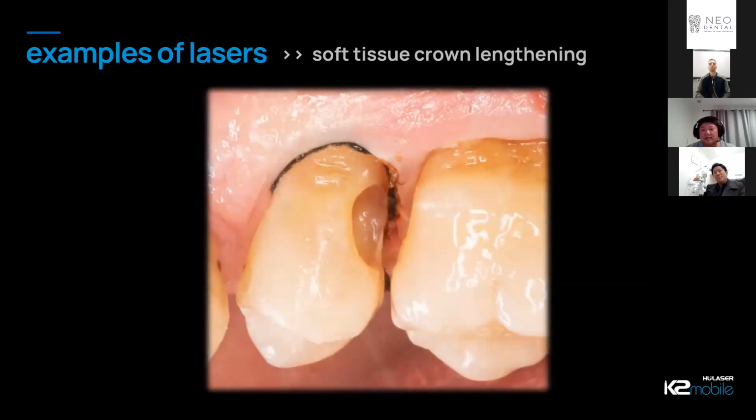And likewise here, this is a combination case where she had quite deep caries into proximity, but I couldn't justify breaking that distal marginal ridge, so we've gone for a buccal access. But there was just a lip of tissue that was growing there, so I've lasered that off, but also placed retraction cords. So I'm not going to teach you how to do your dentistry, but you'll find that sometimes laser alone is sufficient, or sometimes you'll need a combination of both.